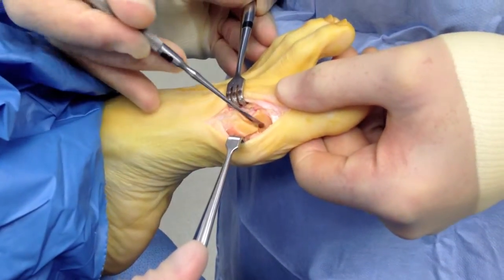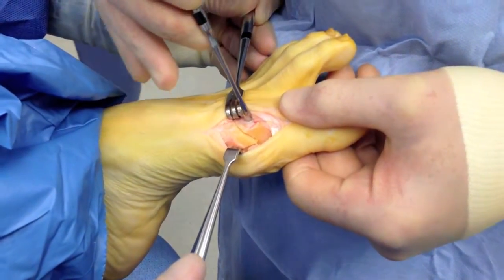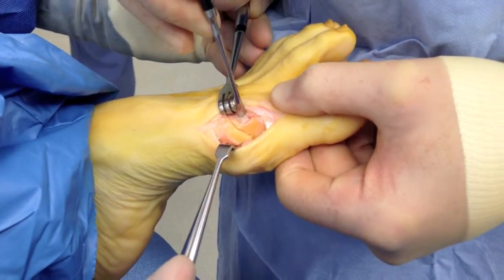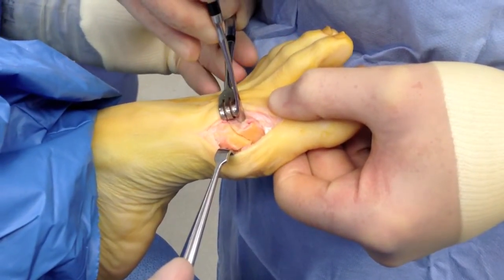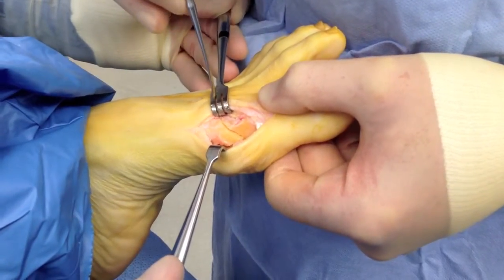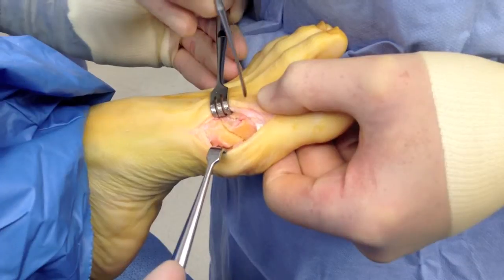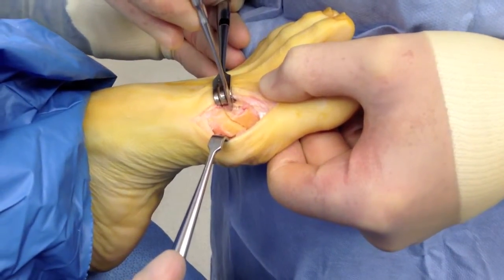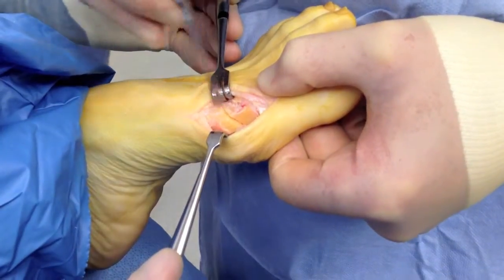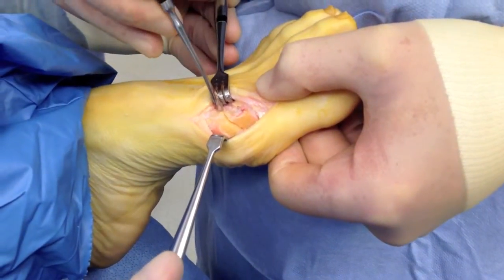Now with this fresh bone cut, we have to fixate the top. We used to use screws, staples, or other types of absorbable pins like Vicryl or other pins that will dissolve over time. But the new ones that are out now — bone pins — are a little bit easier to use and better for the patient because they'll absorb right into the bone.